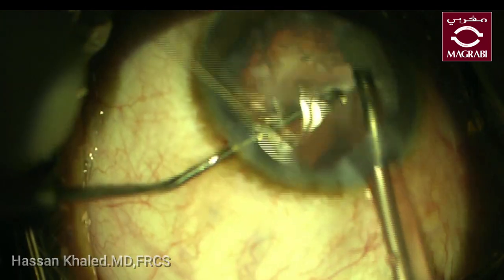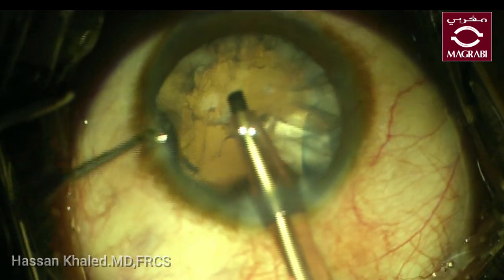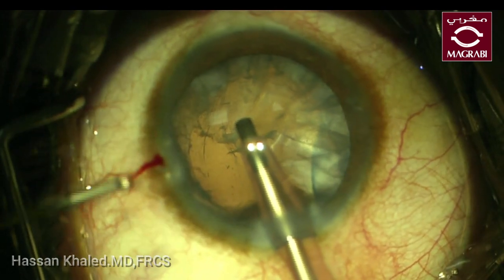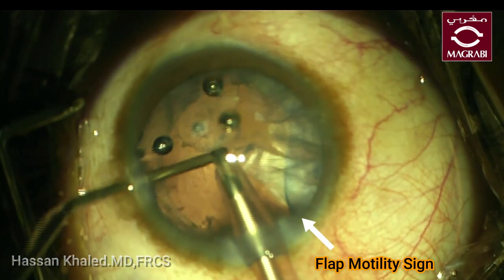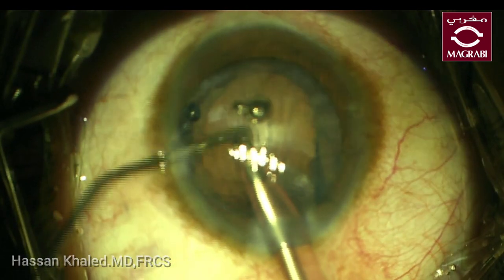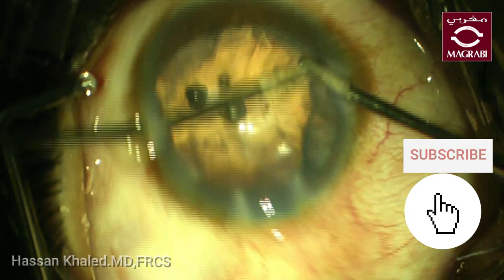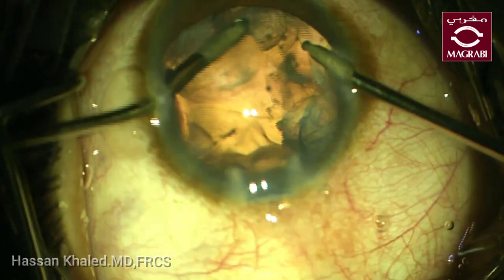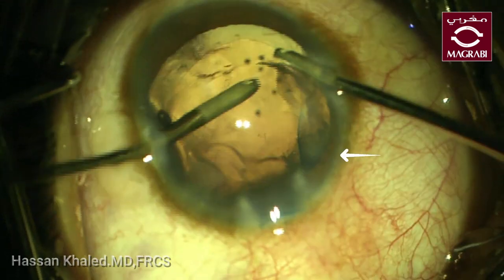You can see here I keep the anterior chamber and capsular bag formed with the irrigation of the phaco, then I inject OVD to form the capsular bag and anterior chamber before withdrawing the phaco from the anterior chamber. You can see the fluttering of the anterior flap — it is averted and fluttering, which is a good sign that the extension is anterior to the equator and does not extend to affect the posterior capsule.